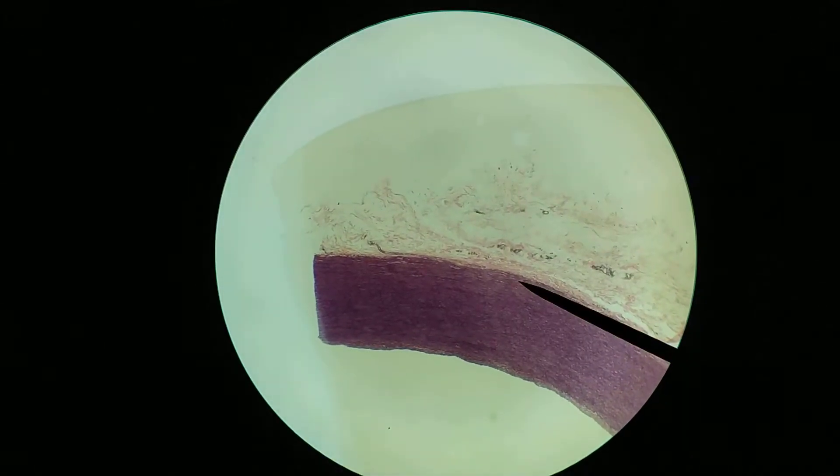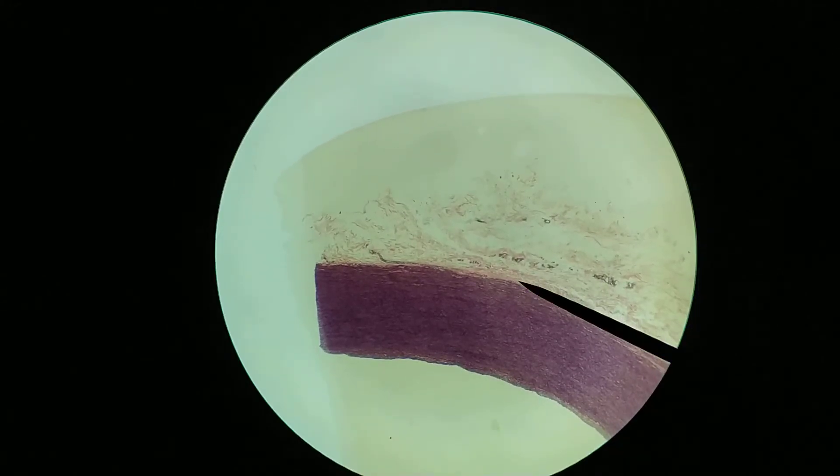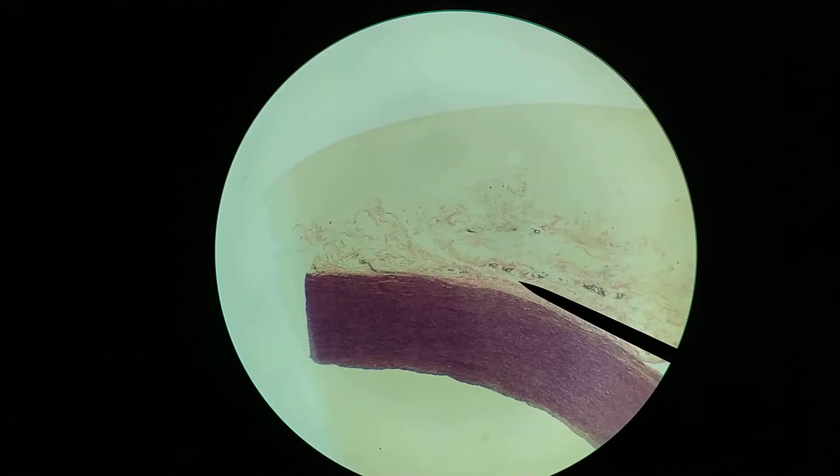This area right there is where you have a much more typical, dense, irregular connective tissue in the tunica adventitia. We'll look at that in some detail in a moment.